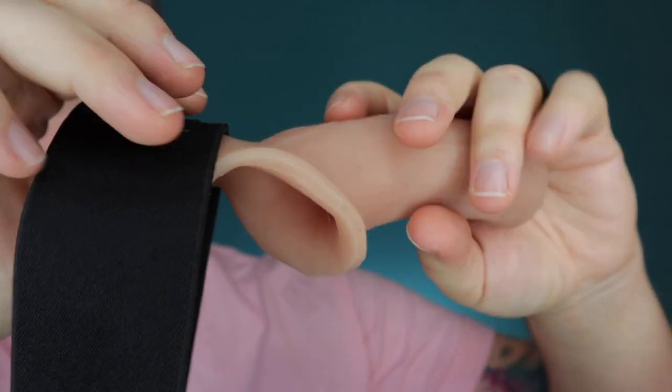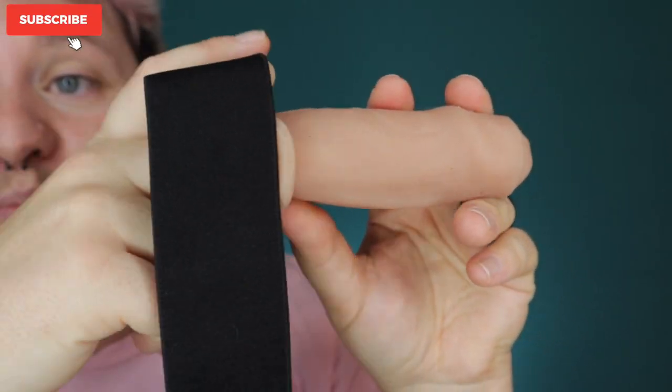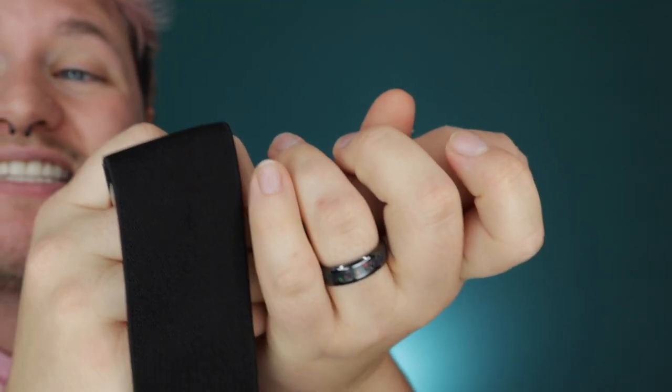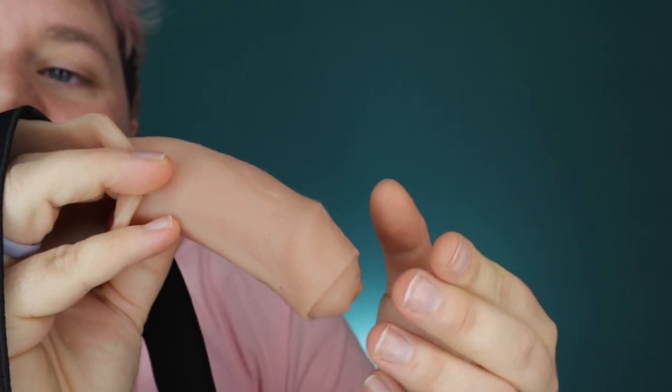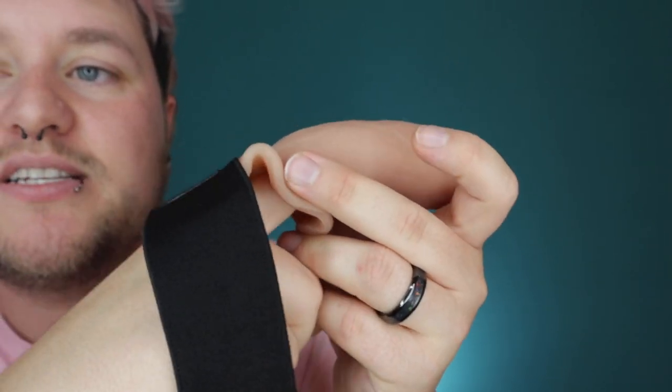I have not had metoidioplasty or any type of bottom surgery. However, the company felt they should still send it to me so I can show you what it looks like, because the owner said it has changed his life — it is a really good prosthetic. If you've had urethral lengthening, you can put your peen in here throughout the day, and when you go to stand to pee, you can hold something a little bit bigger. Some people feel dysphoric because they have to go close to their body to hold their peen to pee, or some people have extra skin and it's hard to even reach. With this, you're able to stick your peen in there and have a little more grip when you're peeing.